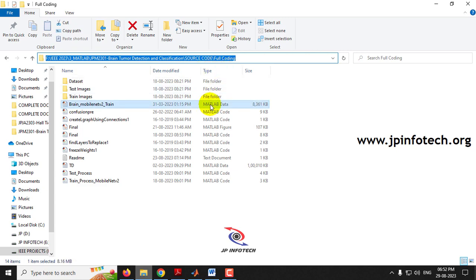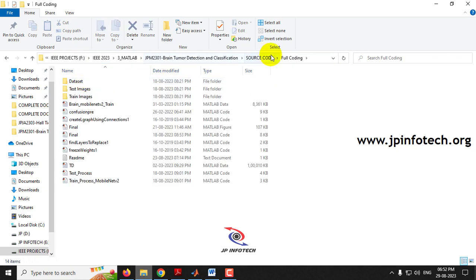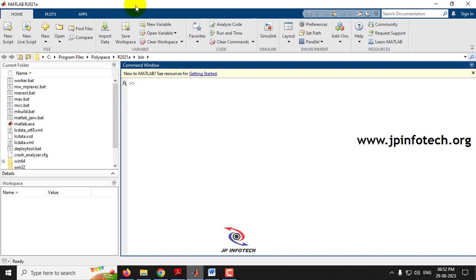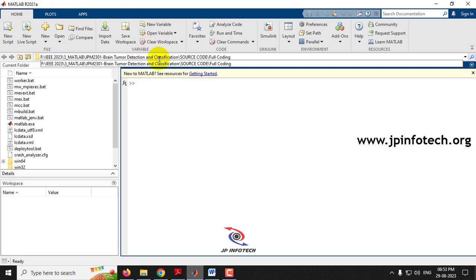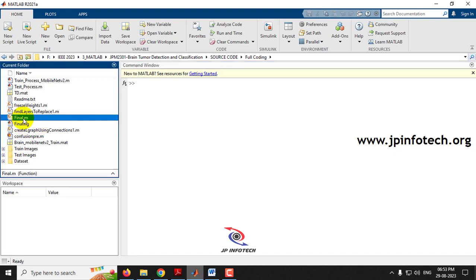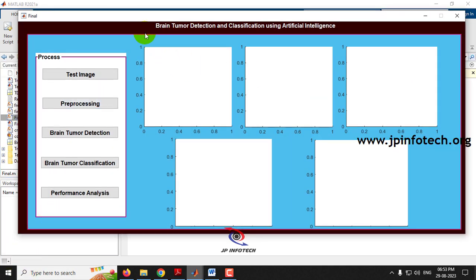To execute the project, copy the source code folder location, open MATLAB R2021a, paste the location in the address bar and press Enter. The project files will load in the left side panel. Select 'final.m', right-click and select 'Run'. Wait until the GUI loads — you can see the project GUI with the title 'Brain Tumor Detection and Classification Using Artificial Intelligence'.